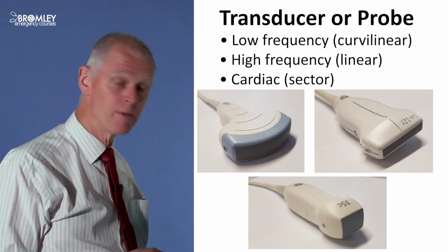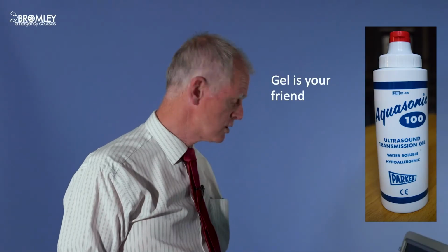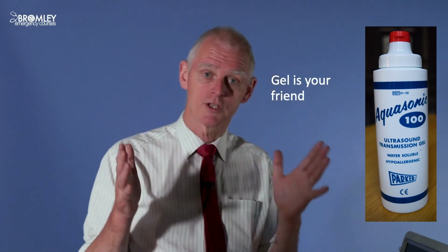Okay, so those are your 3 main probes: curvilinear, linear array, and cardiac probes. I just have one more subject really to talk about. Okay, and that's about gel. So, gel. And I want to just talk about ultrasound for a moment.